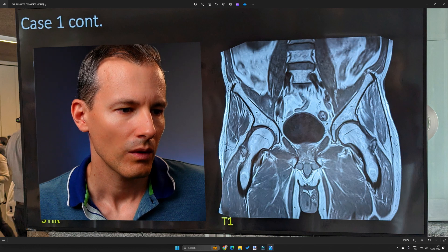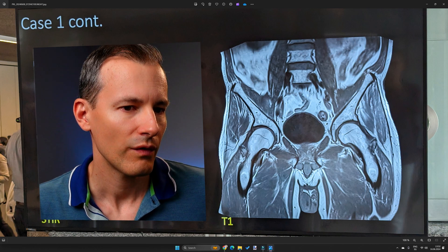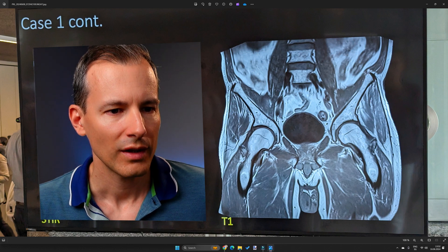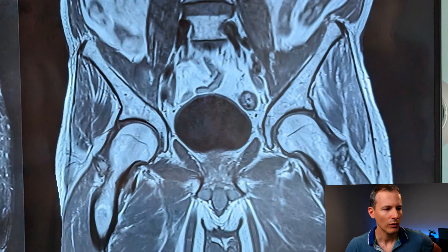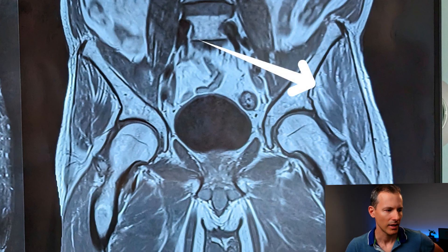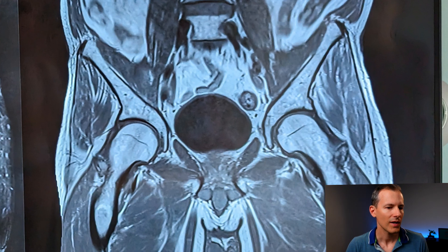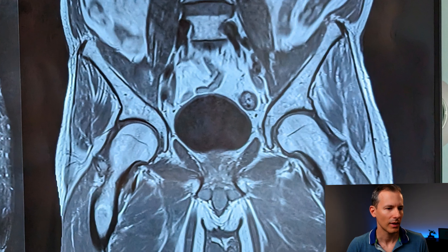The reason they show the T1, I believe, is just to assess the muscles. We don't see a large amount of fatty infiltration, atrophy, or marked asymmetry. Importantly, we don't see a mass underlying the edema — the fatty streaks are within the muscle, the fat planes are normal, and the architecture is not distorted. This gives high suspicion that this is just normal edema and not some other underlying cause.